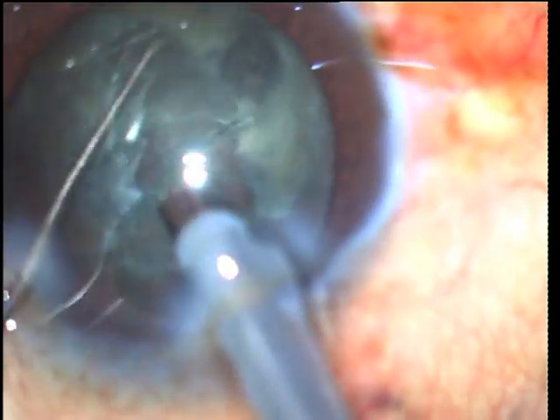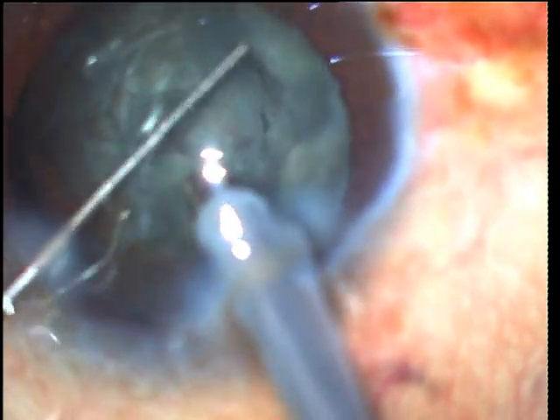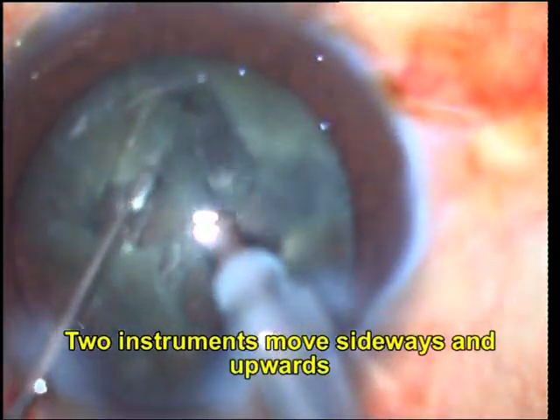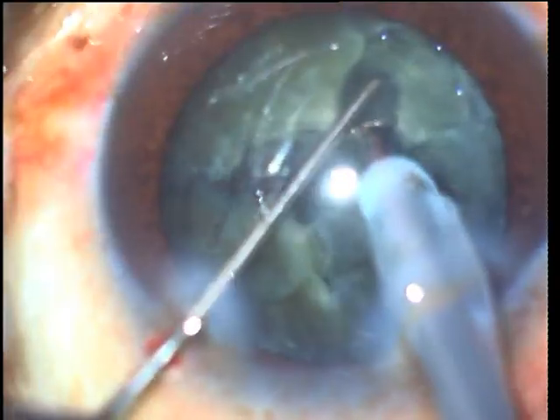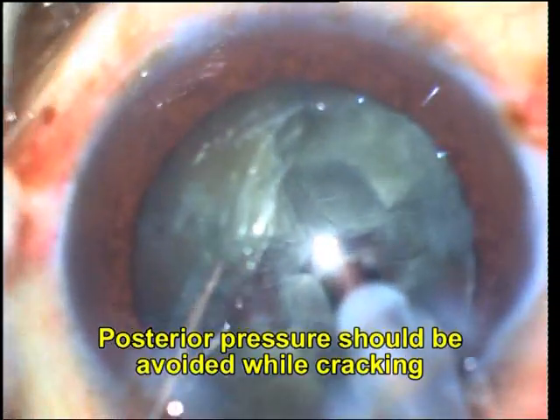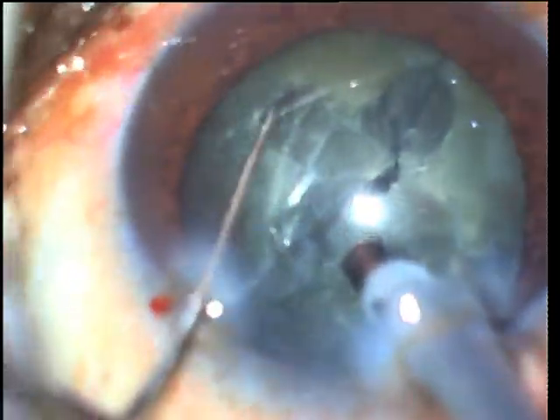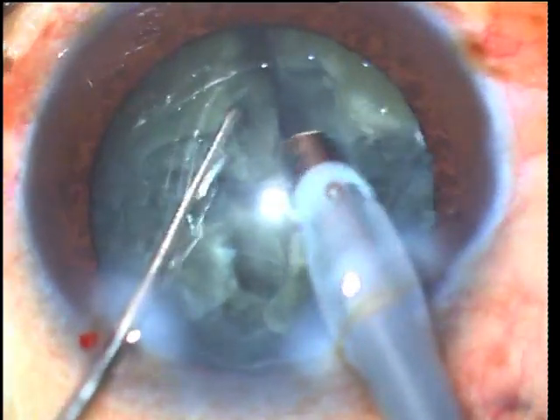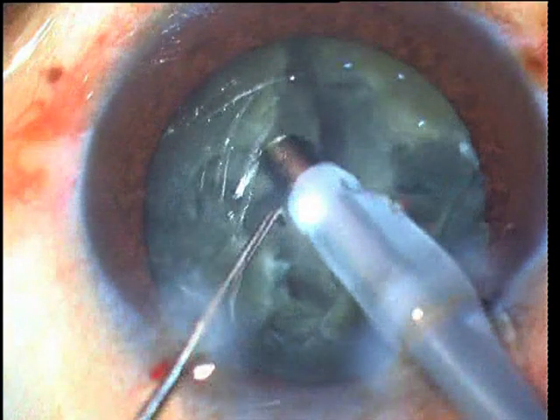Once this is done, it is again rotated 90 degrees and the four quadrants are thus created. It is important to make sure that the posterior plate has completely been cracked, and for this it is especially important that the central part of the nucleus is also sufficiently thin. Not performing downslope sculpting while grooving can lead to a thick posterior plate which refuses to crack.